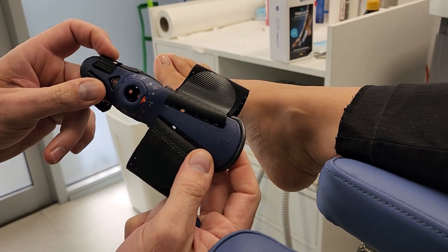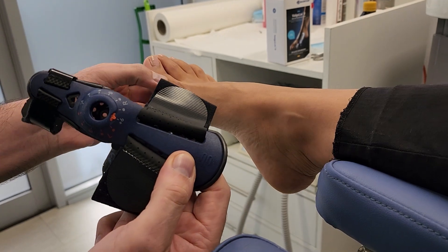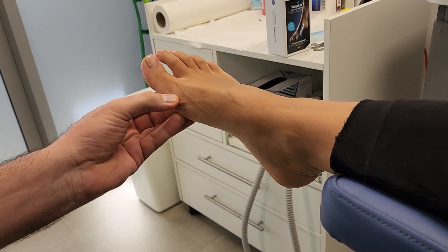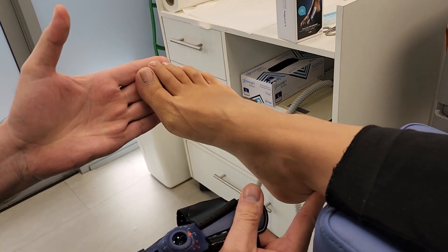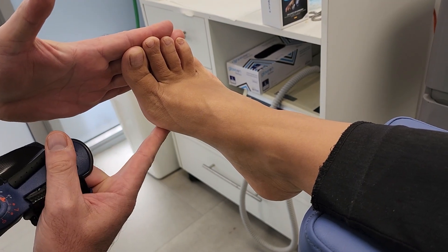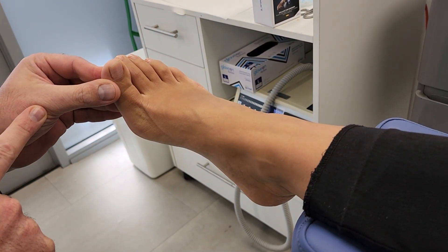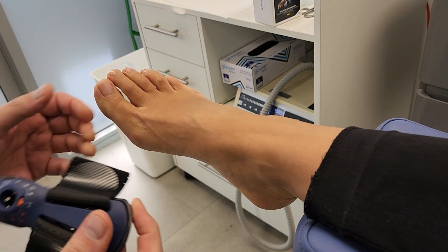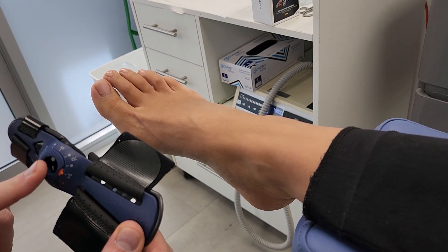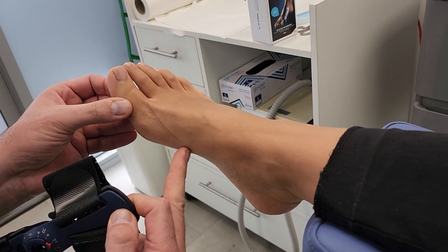It's actually a bunion brace, but it works fantastic for patients with hallux limitus, anyone who's had an osteochondral defect of the first metatarsal head, anyone who's had a hyperextension injury or a turf toe where they've injured the plantar ligaments or have had compression dorsally during that injury.